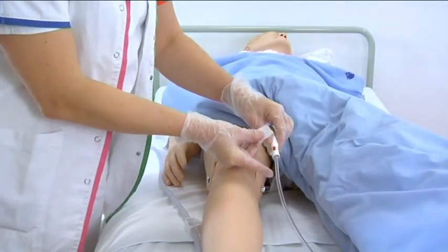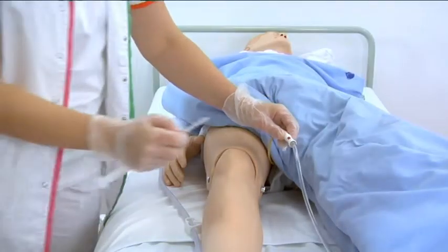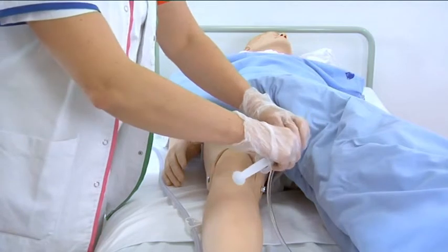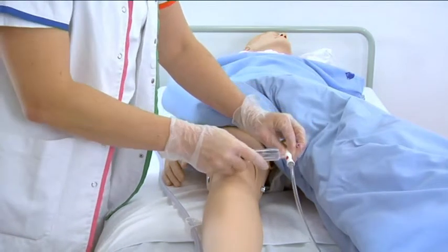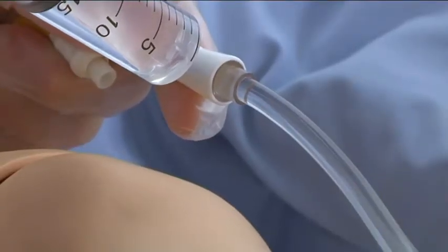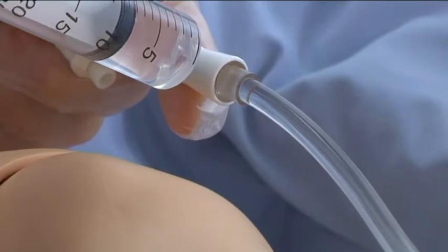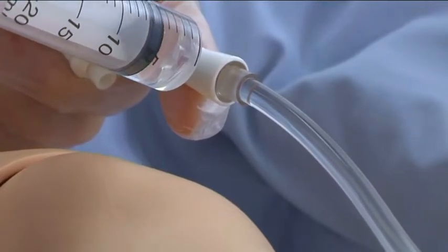Follow the local procedures to clean the sample port nearest to the Foley catheter. Prime the system with 20 milliliters of sterile water. This is only needed once.